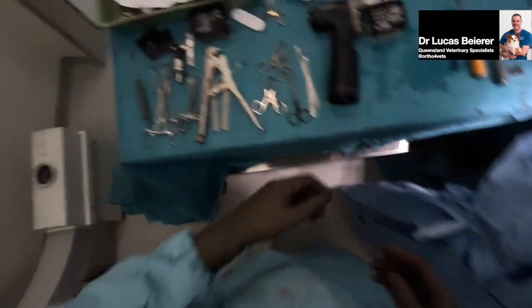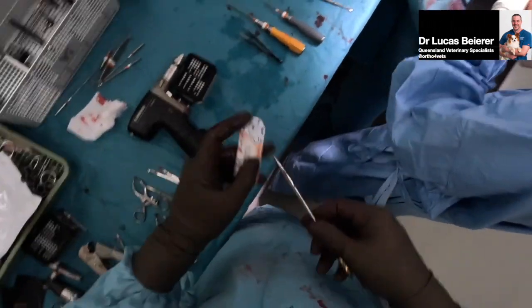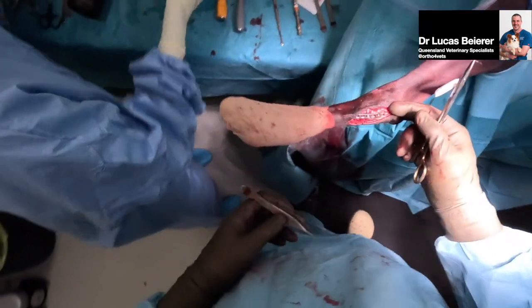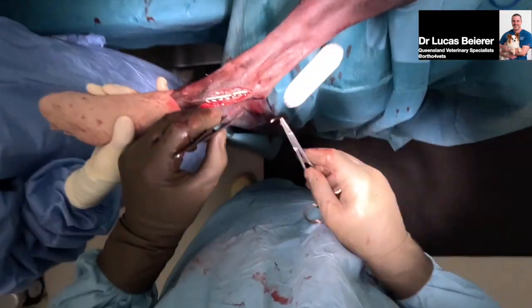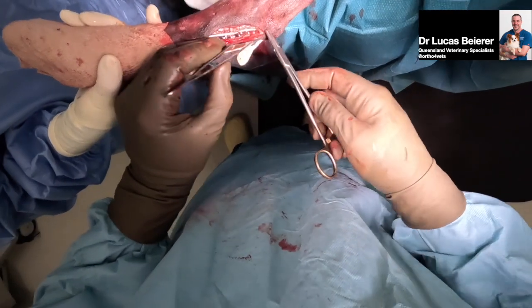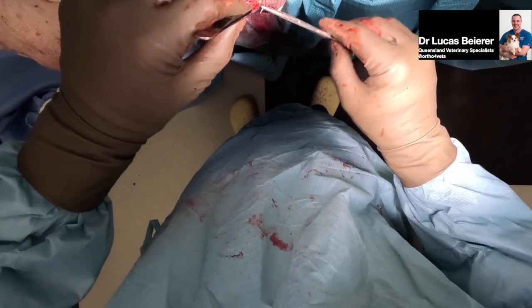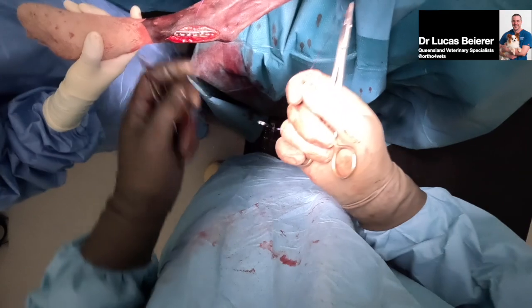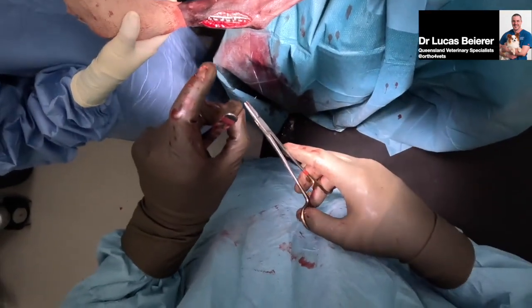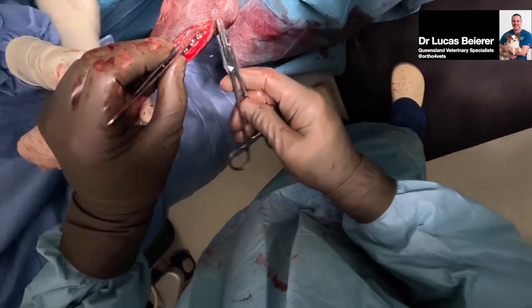What do you think? You're going to have luck closing or no? It's a long pause. It's not quite the enthusiasm I was looking for. So I think just getting a really superficial subcut layer, almost just shy of an intradermal, is the way to go. It's the only way you can get these closed. If you go sort of deep like you typically would, you just don't have enough material to work with.